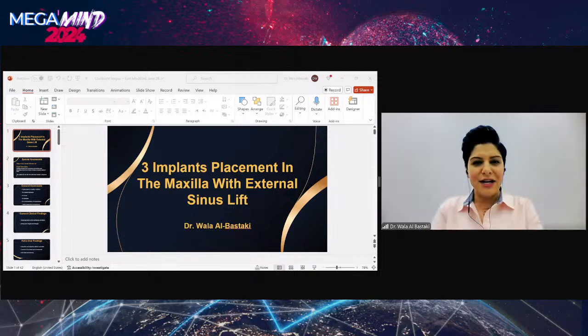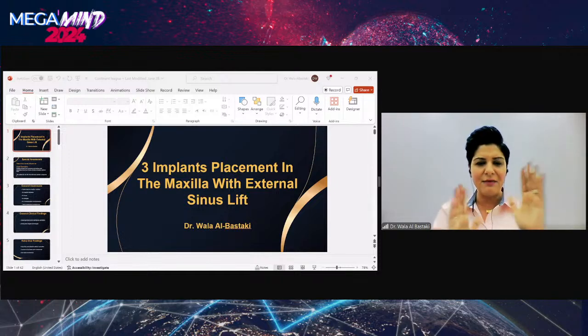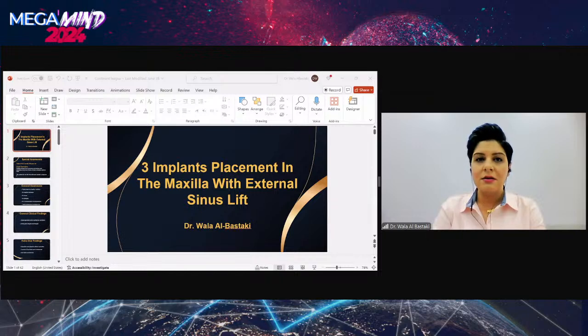If you performed the external sinus lift, why have you chosen short implants? I believe that 11 mm would be a good length of implants because in the latest articles I've been reading, usually they are trying to go away from the very, very long implants. I believe 11 mm would be good in her case. Because you have so much bone substitute material in the sinus now, and comparing the length or volume of the material and the length of the implants, you have a lot of material above your implant.